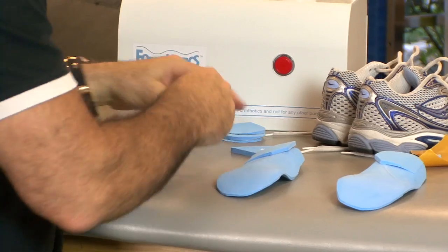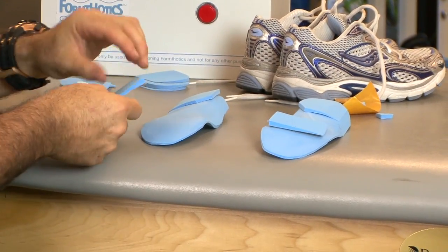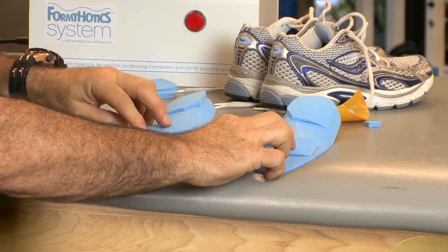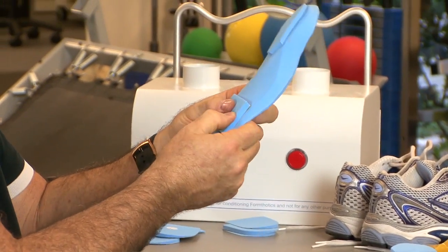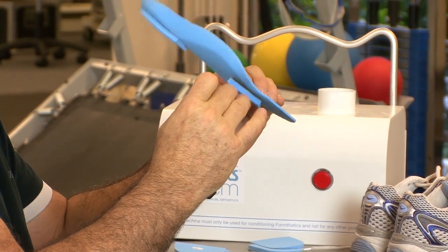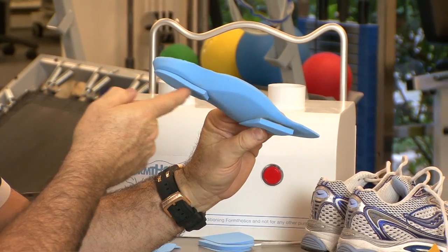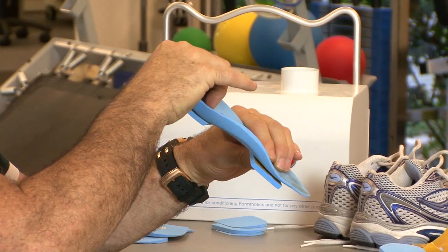We can add a forefoot post. I like to gradually build up the orthotic — a possible approach is to put a forefoot wedge underneath the metatarsal where the first ray builds up the most, again as a varus post. That way the foot sits in a much better position, which we'll show in a minute.